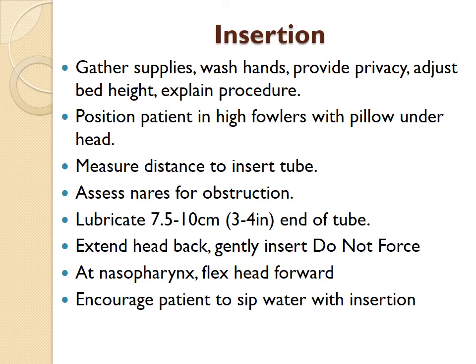Now, some facilities tell you to bring that little emesis basin. I suggest that you bring a big basin, depending upon how obstructed, how distended they are. Once that tube goes in, it's like rupturing a balloon when it gets through that cardiac sphincter, and all kinds of content can come out through the tube but also around it.